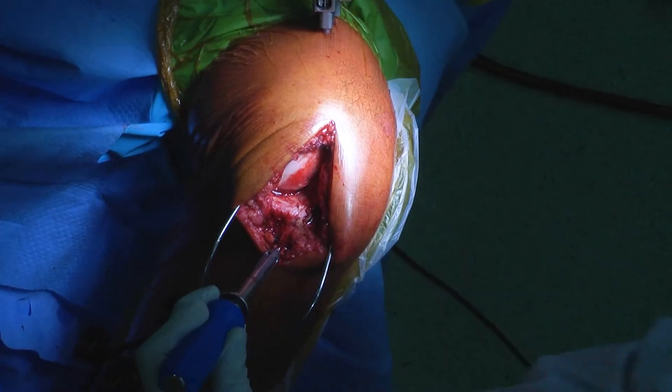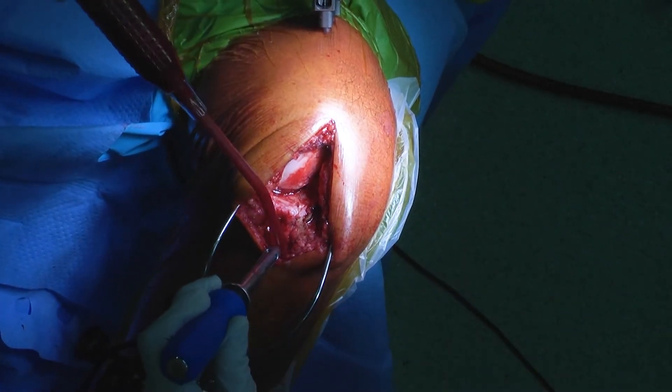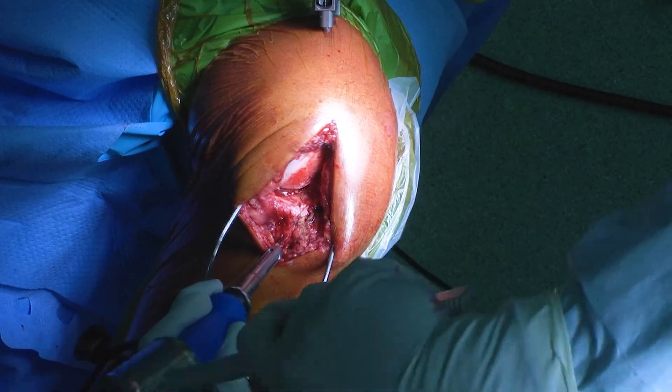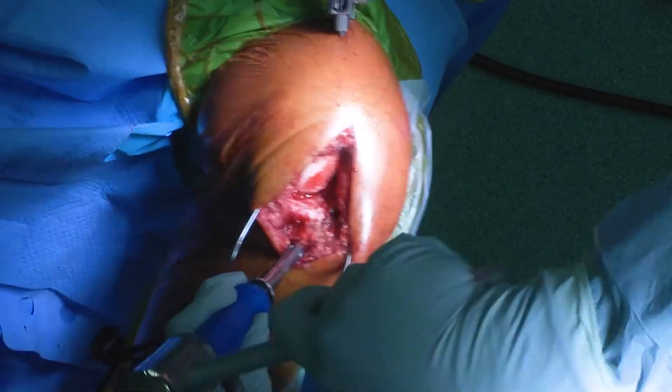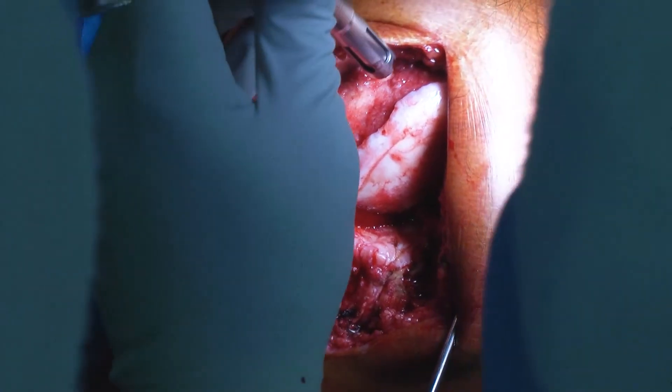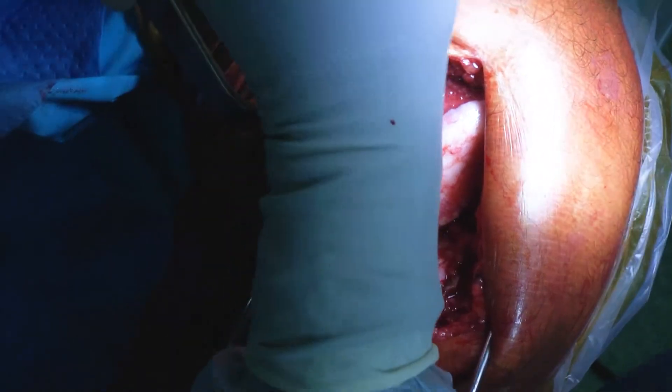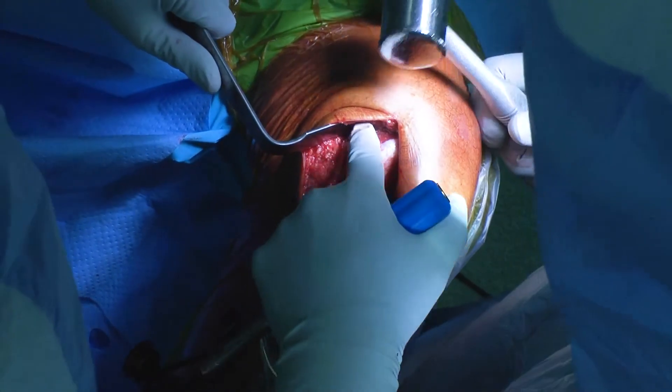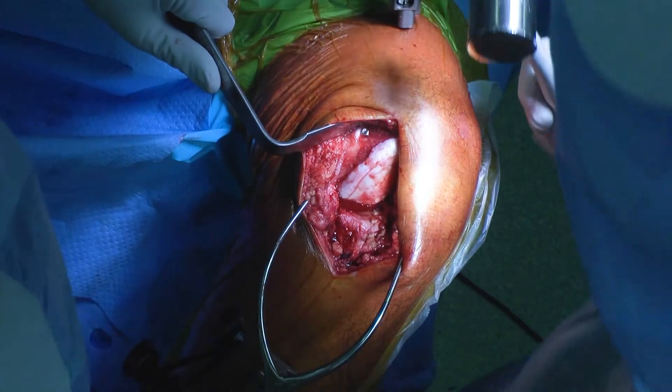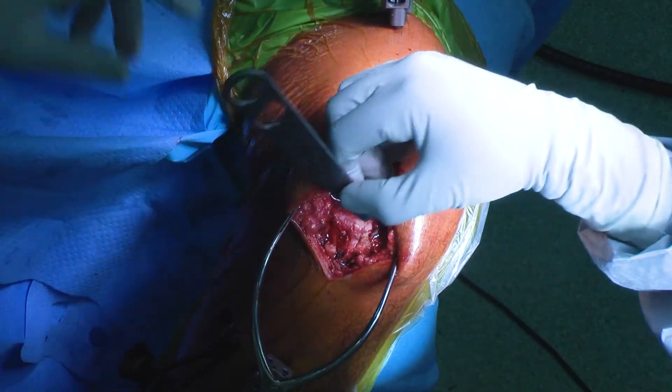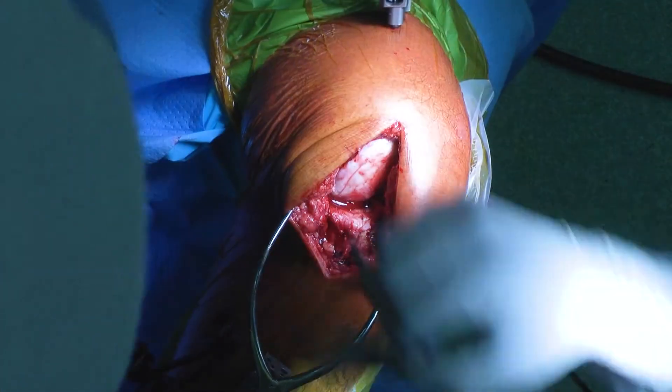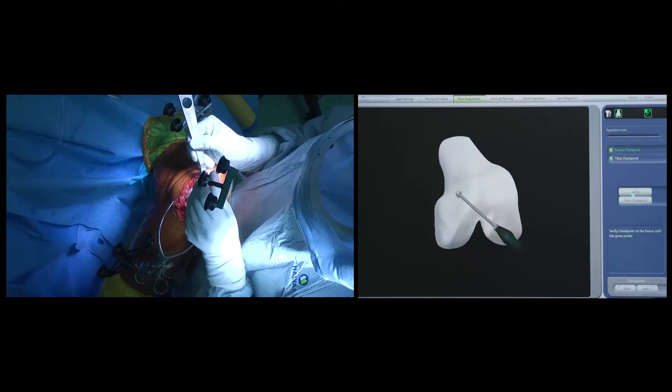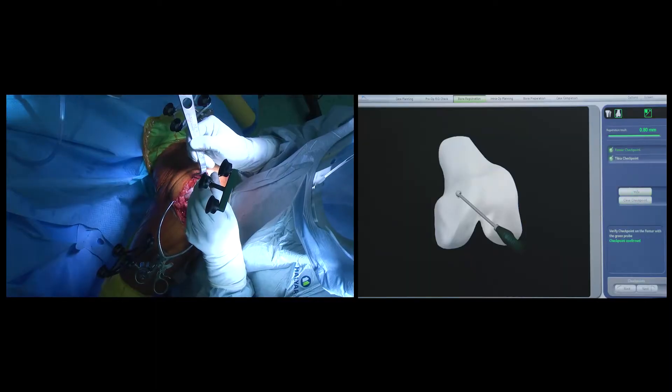The next step is impacting in place the tibial and femoral checkpoints. These checkpoints are constant landmarks that we can always go back to, to ensure that the tibial and femoral trackers have not been bumped or moved during the operation.